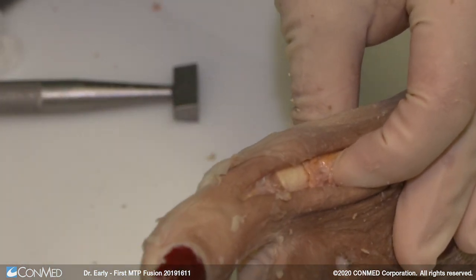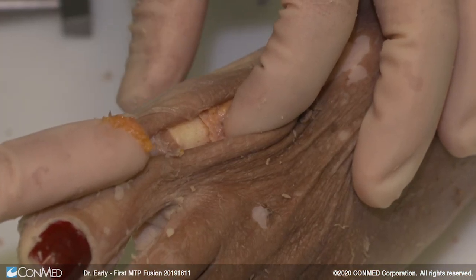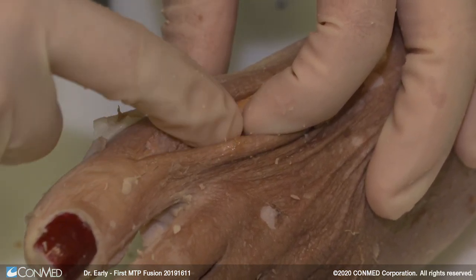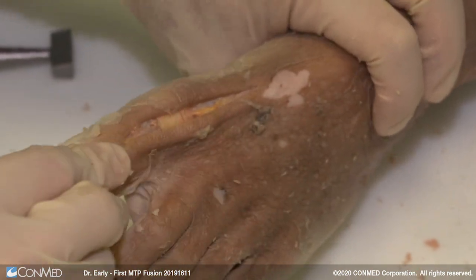Then your implant of choice — whatever plate you want — goes over top. You have all that cancellous material that your reamings came out, and you'll put them along each cortical side to fill it in. Now you see with that core alone, there's the stability you have.